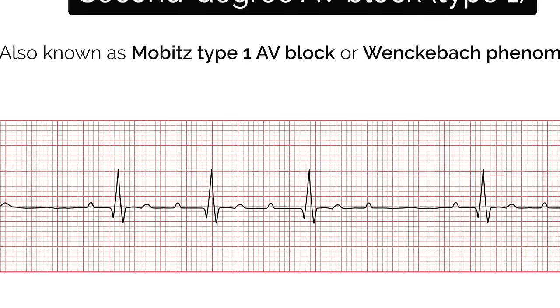U waves become larger the slower the bradycardia. Classically U waves are seen in various electrolyte imbalances, hypothermia and secondary to antiarrhythmic therapy such as digoxin or amiodarone. This concludes our structured approach to interpreting an ECG. Once you've interpreted an ECG it's important to document your interpretation in the notes — you should include the patient's details, the time and date the ECG was performed, your interpretation of the ECG, and your overall impression and plan.